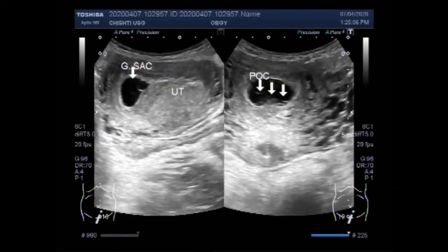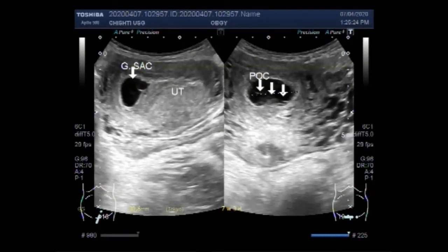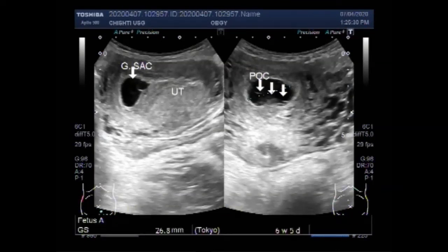You can see again the products of conception inside the gestational sac. When a follow-up ultrasound still shows no sign of a fetal pole, or the gestation sac — which appears as a white rim around a clear center and will eventually contain amniotic fluid and enclose the developing baby — remains empty, it means miscarriage has occurred.